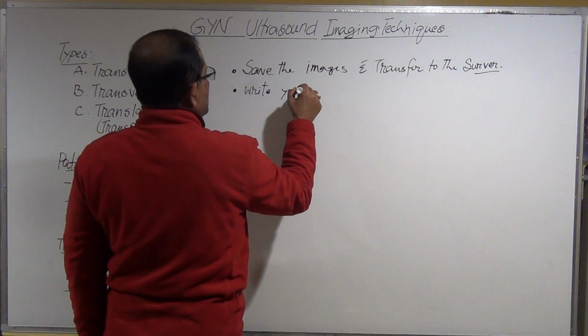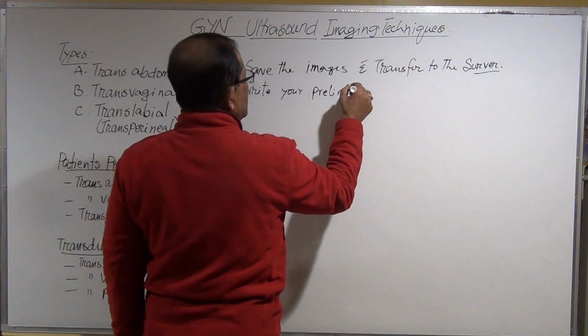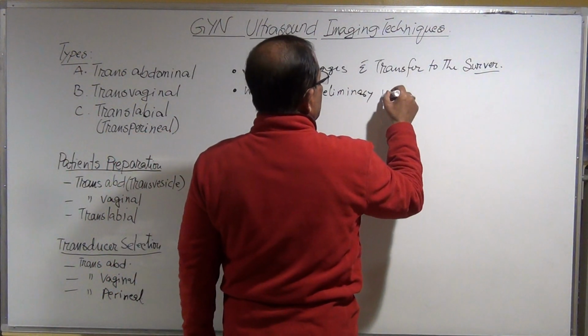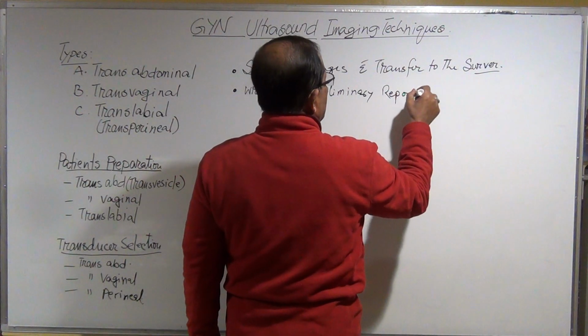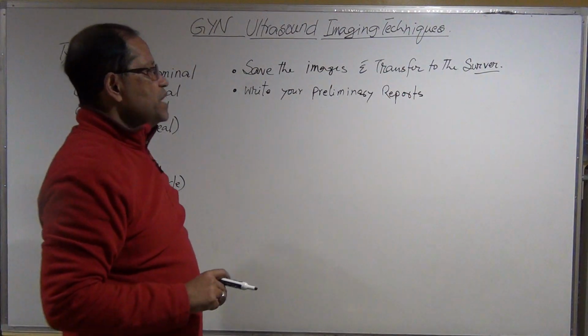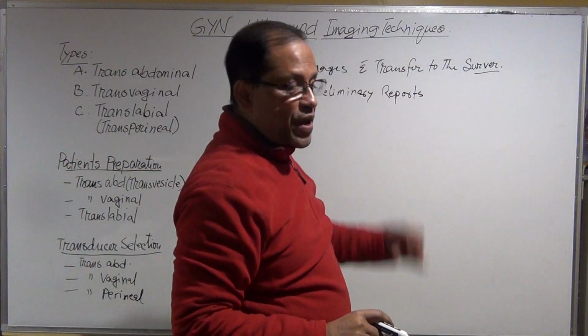Write your preliminary reports. In the preliminary reports, what are you going to add?